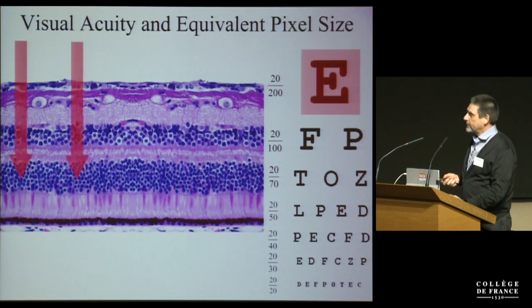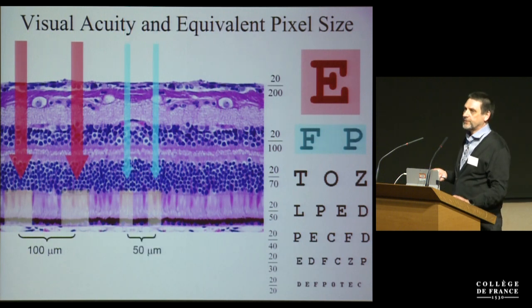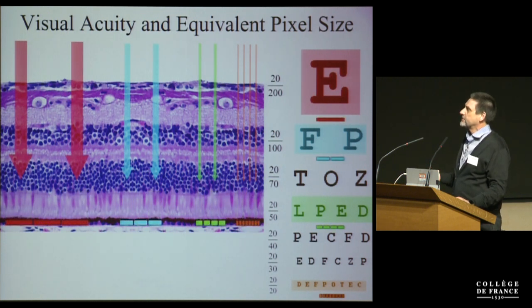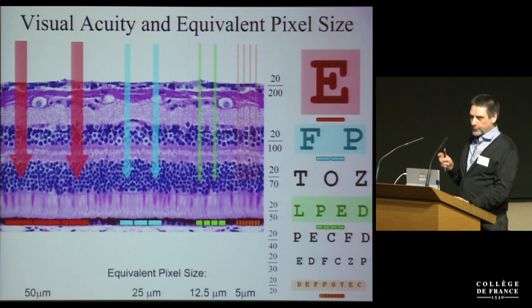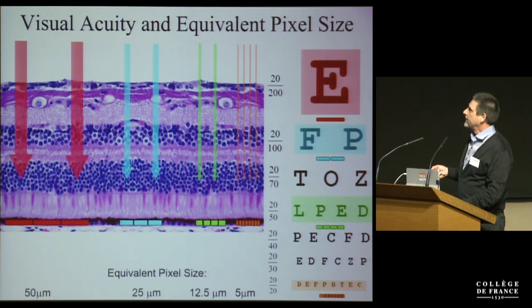Now the other important question is how much information we actually need to deliver, or how many pixels are required for different levels of vision. In normal vision, which is 20/20 visual acuity in American units, 6/6 in European, the frequencies on retina are 10 micrometers per cycle. So to sample it, we need pixels of at least 5 micrometers in size. Legal blindness in the US is defined as 10 times worse acuity, and it requires pixels of at least 50 microns just to sample this information. I'm not talking about even encoding, just delivering enough information for perception at that level.